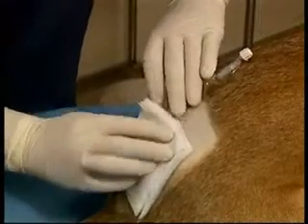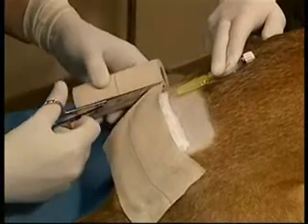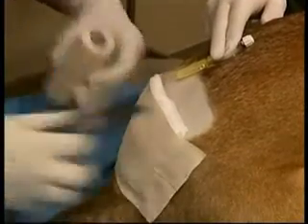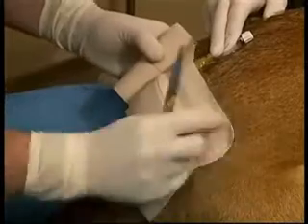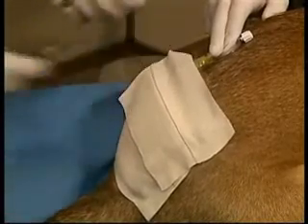Once an appropriate stress loop has been created, the remainder of the catheter is coiled underneath the dressing, triple antibiotic is applied, followed by sterile 4x4s, and either Elastikon or other water repellent dressing is stapled to the skin to hold everything in place.